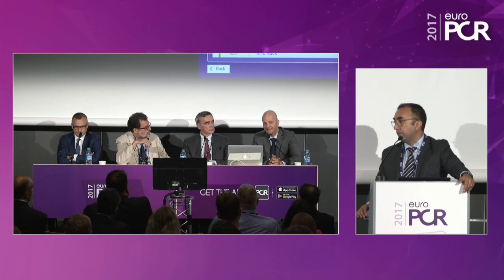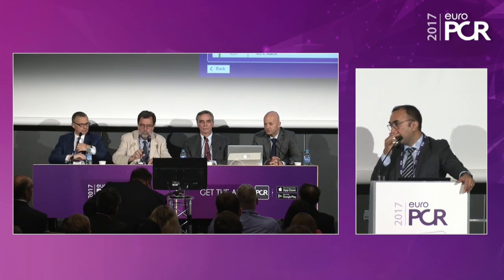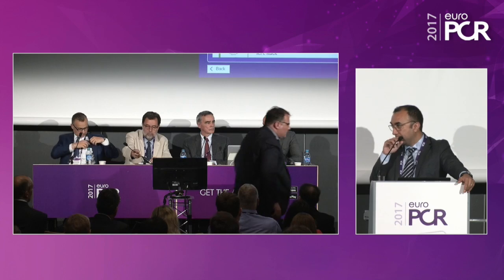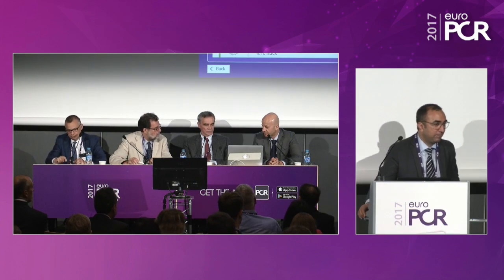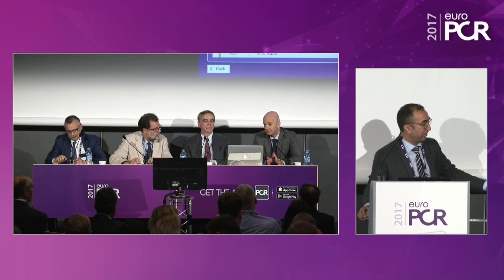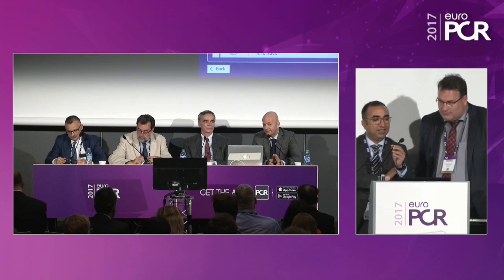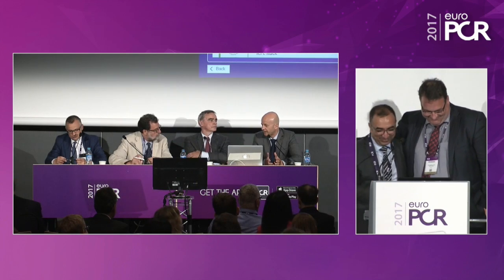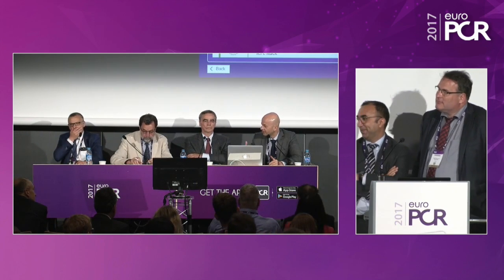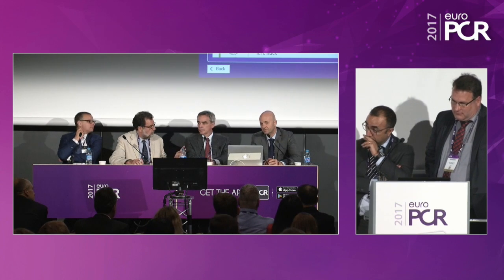Yeah, again, it's a preliminary experience. First of all, what technique would I use first? I would first go for a Cardioband procedure in a patient where the leading pathology is, of course, annular dilation. And then if that patient has not a completely reduced MR and maybe has a part prolapse and also long-running DMR, then you can combine it with a MitraClip.